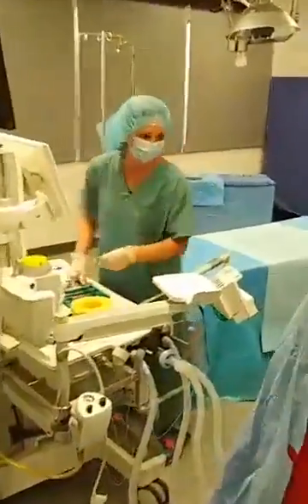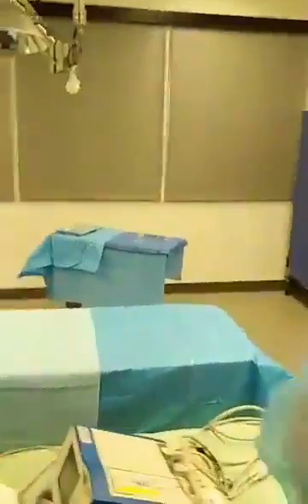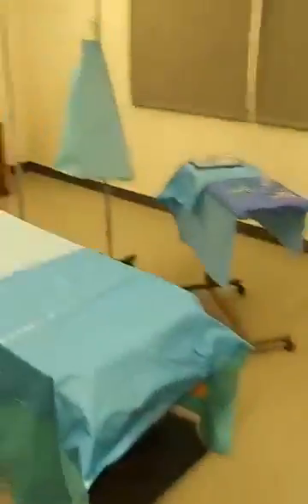Hi guys, I'm Dr. Waters, anesthesia. Hi, Dr. Waters. How about you guys pass me over your oxygen tubing, we'll get you off your tank. Bernie, can I get you to grab the pulse for a minute? Coming at you guys. Guys, I'm just going to do a quick assessment while you hand over a report, okay?